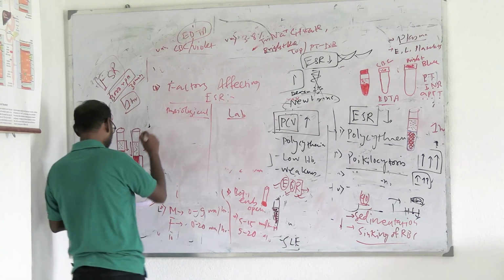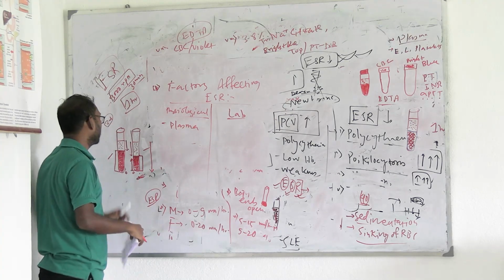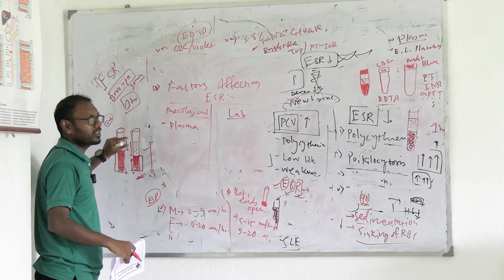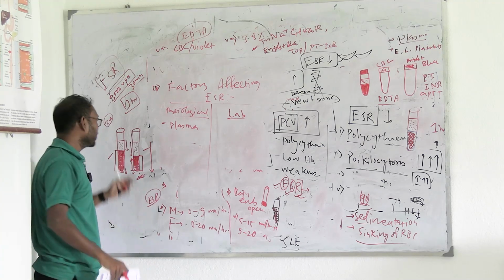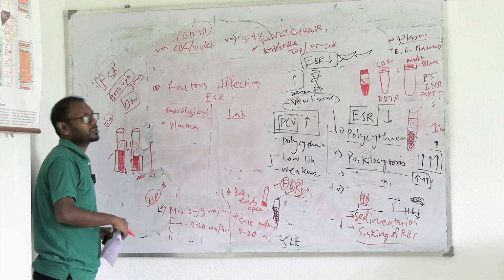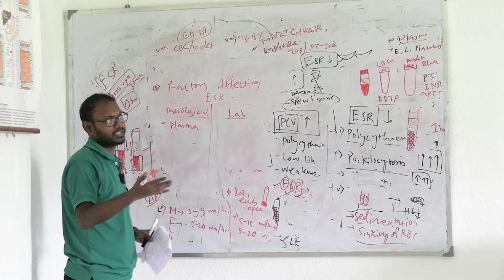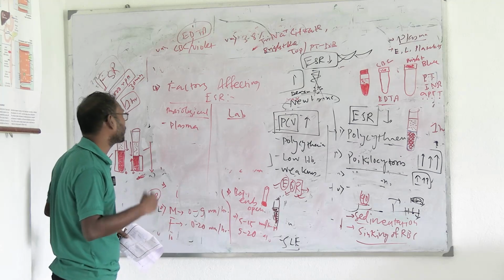So physiological factors are plasma. So when the person is having a lot more plasma level in their body, just like in pregnant women, ওদের অনেক বেশি প্লাজমা থাকে, and in those persons which have less plasma level in their body, like after a road traffic accident or after any kind of trauma which has a lot of loss of fluid.